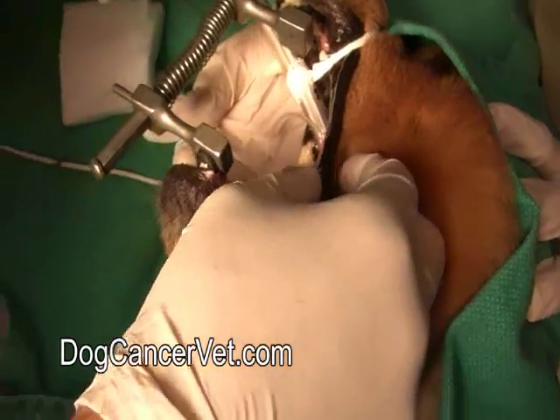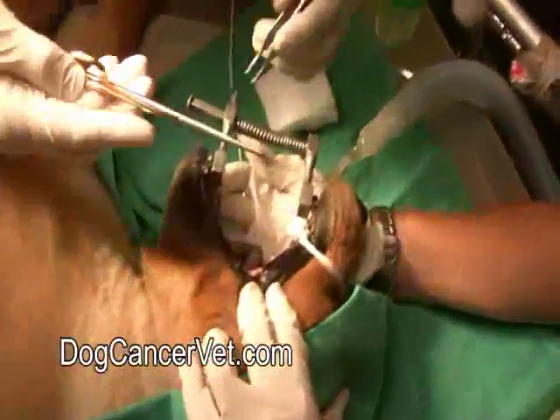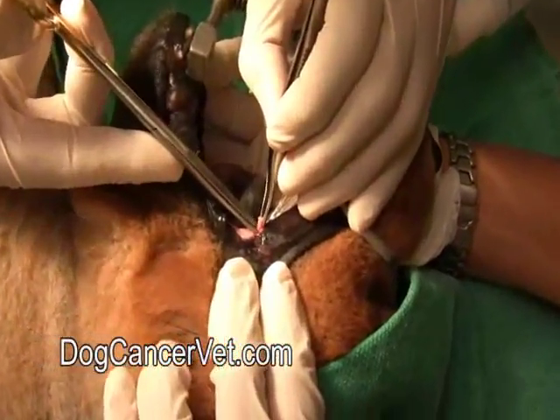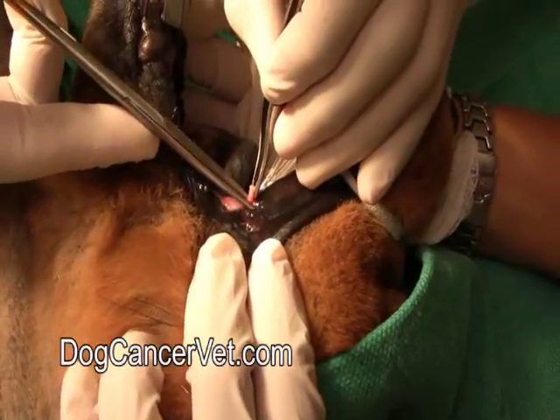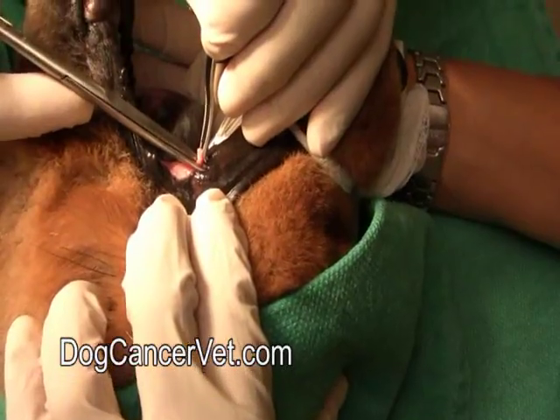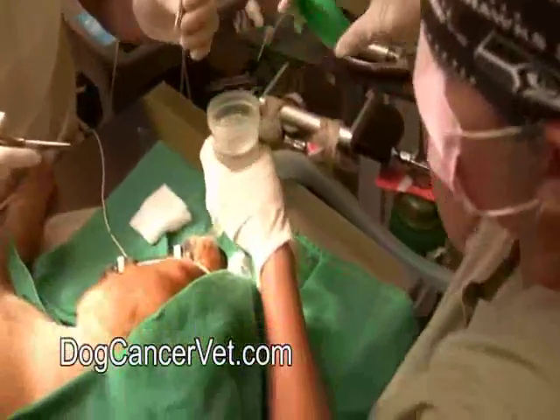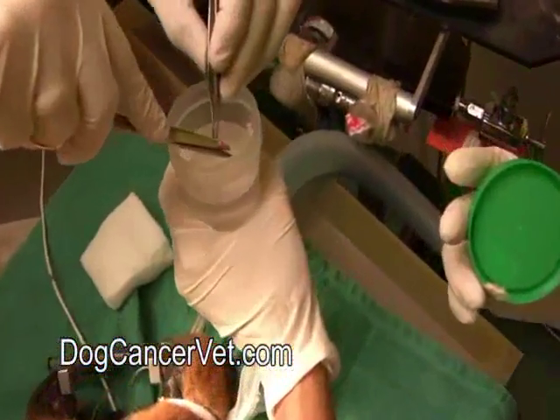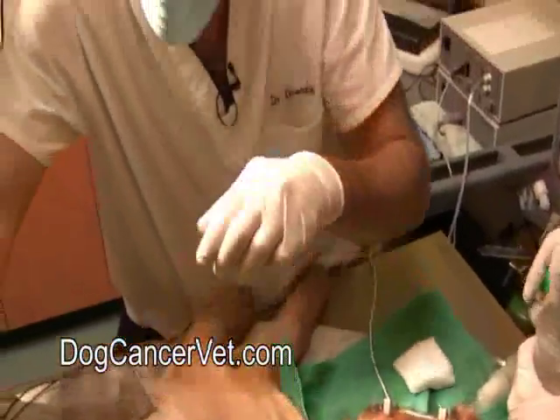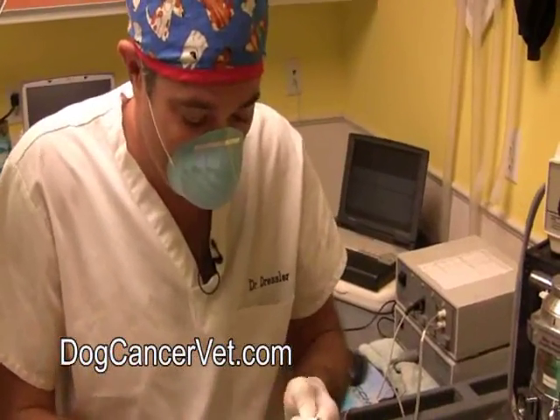Fabulous. There's my piece. Now I'm just going to remove that with little scissors. And I want to make sure that I get it nice and deep. Again, you don't want to miss any cells in there that the pathologist might need when they're making the diagnosis. Okay, it's going to go right in this formalin. This is a preservative. That way it doesn't break down when it's in the Federal Express package over to the lab. Now what we're going to do is simply put a stitch in so that we can close that area up and it doesn't get infected.